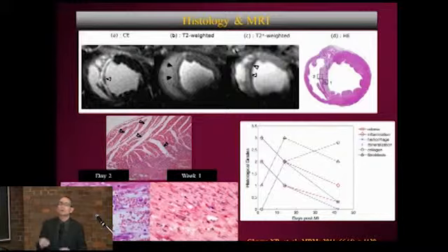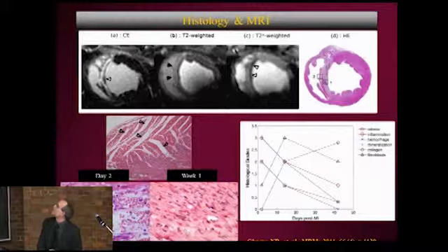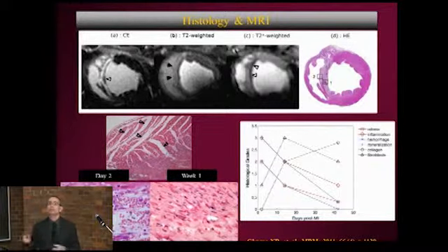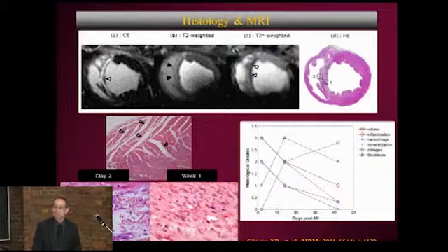And essentially, in this animal model, we repeated that study on autopsy by looking at histology at various stages. And we see very similar behavior as was seen in those autopsy studies, where you get this initial edematous response and inflammatory response, and then this buildup of fibroblasts and ultimately the deposition of collagen, which leads to this adverse remodeling. So we think we've got a good model that reflects what the autopsy studies showed in patients. So now, can the MRI show that same kind of evolution, and maybe give us some more insights as to what's going on in the damage, which might give us opportunities to find new adjunctive therapies?